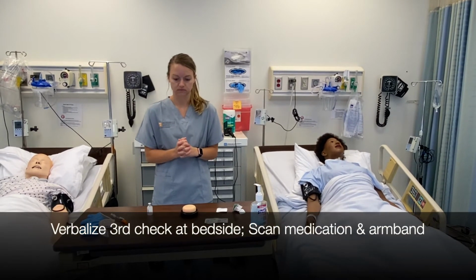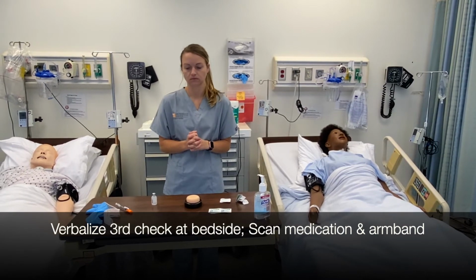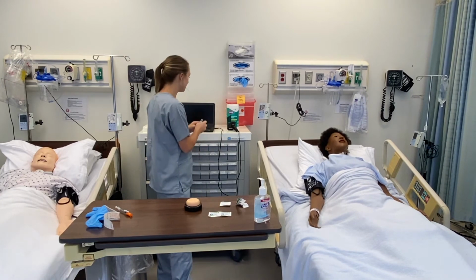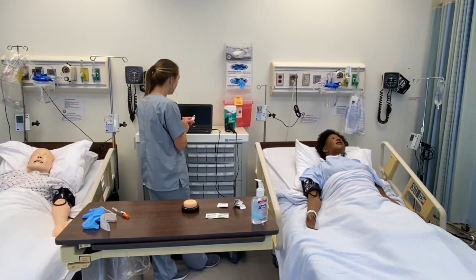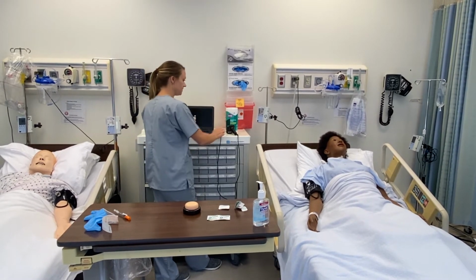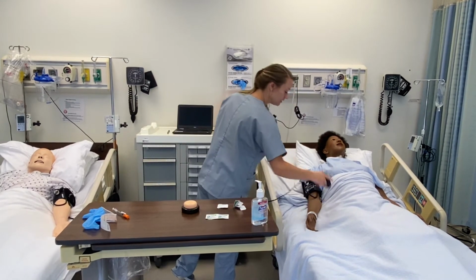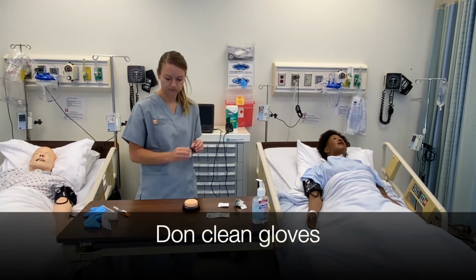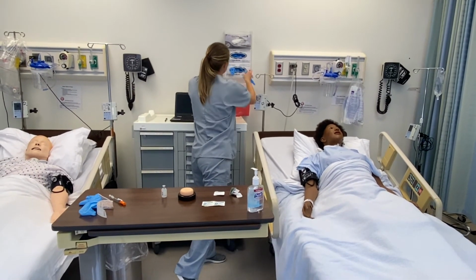Verbalize third check at bedside, comparing medication label to EMR. Scan medication and scan patient armband. I'm going to do my third check at bedside. I'm going to be giving NPH SubQ now. I'm going to be giving 10 units, which is 0.1 ml, to Miss Susan. Scan it, scan her, and scan my medication. Don clean gloves.